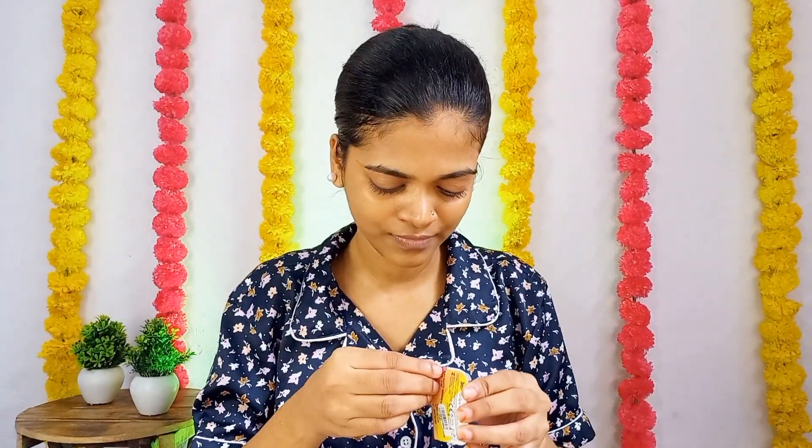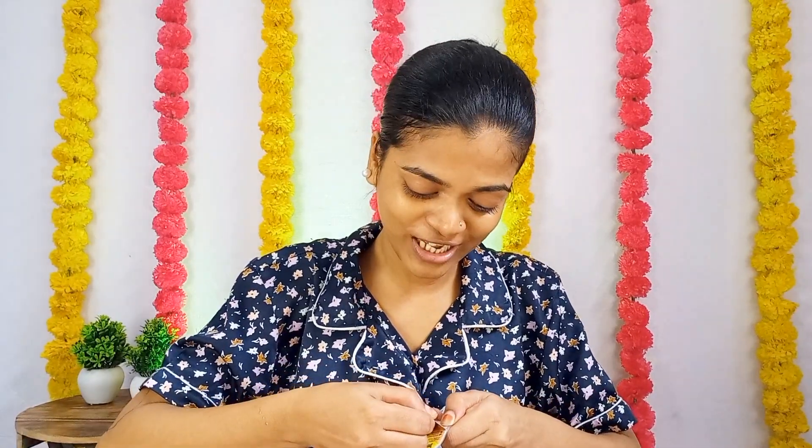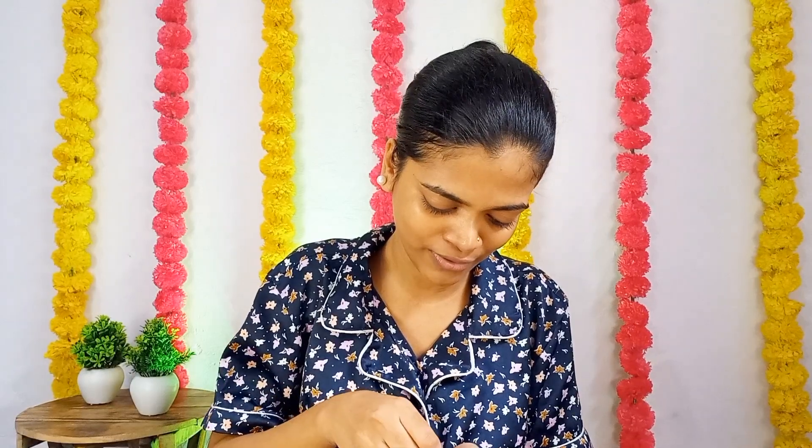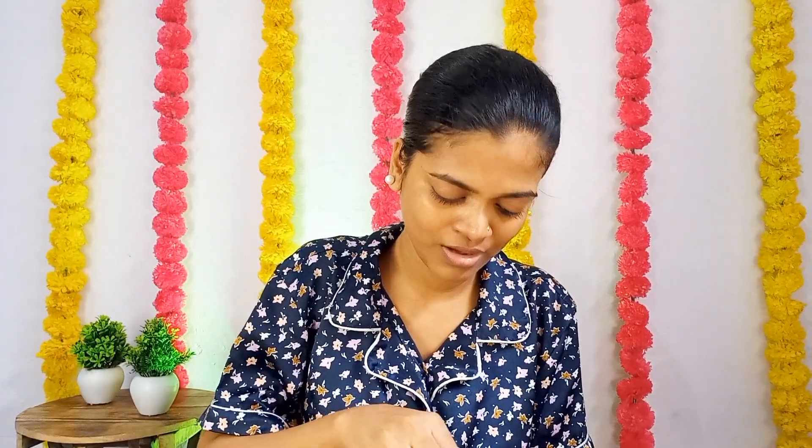First of all, we need to clean our hands — I've already cleaned my hands. Now I'm going to take the lens out using the lens solution and try to put it on. I'll take the lens out this way — you'll see it right here.